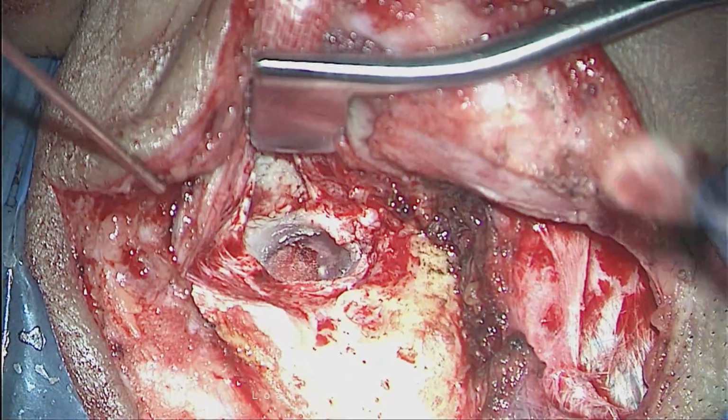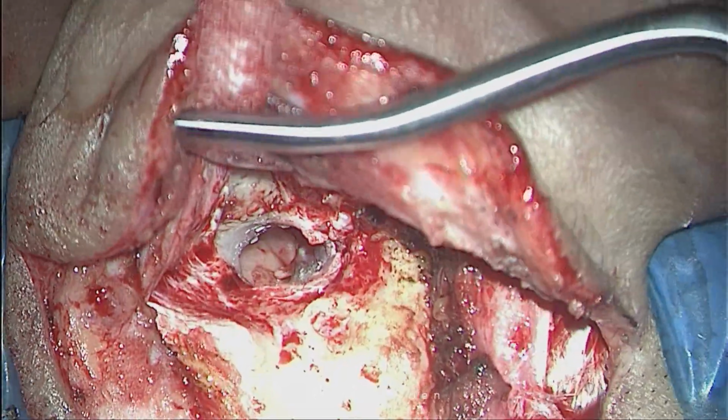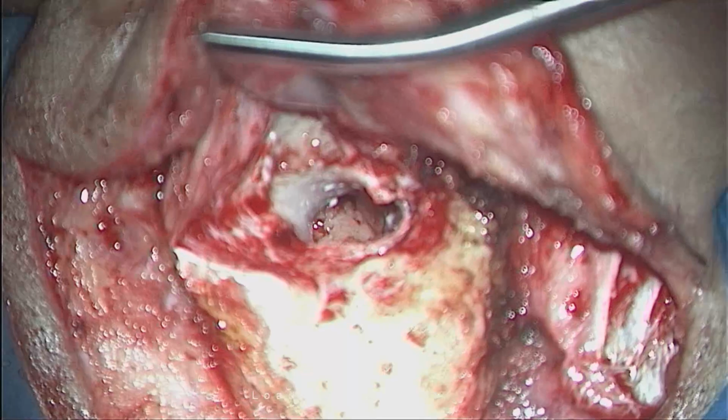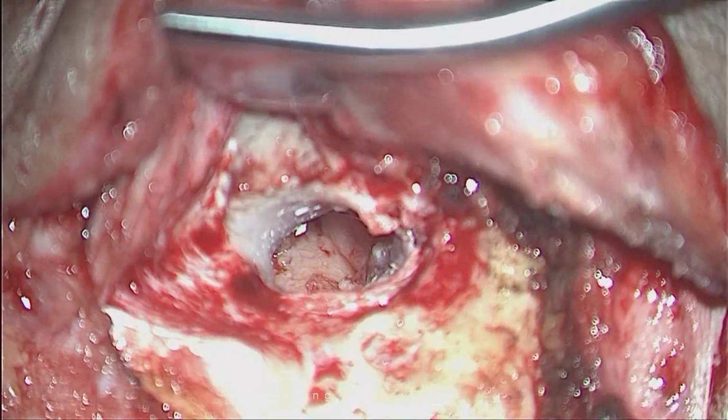So the post-aural incision was given and the margin freshening was done. These are two things which have already been done to save a little more time for important issues. Can you see the picture? Yes, sir. Now it's clear.